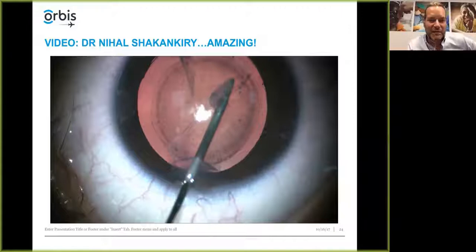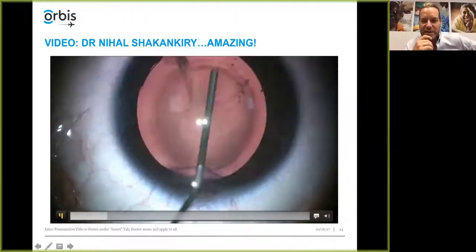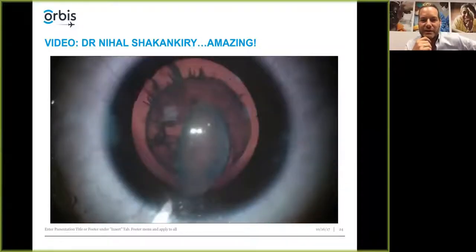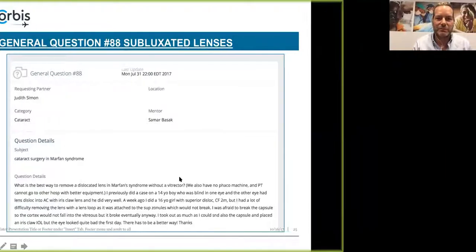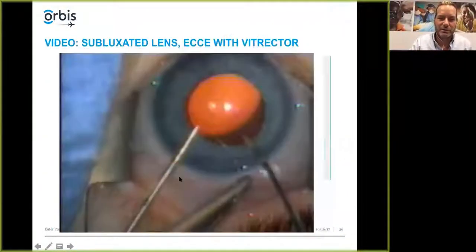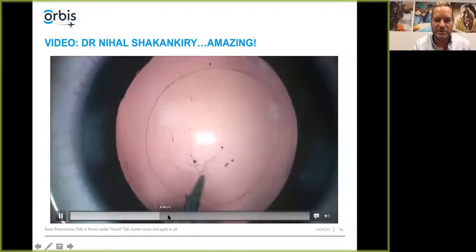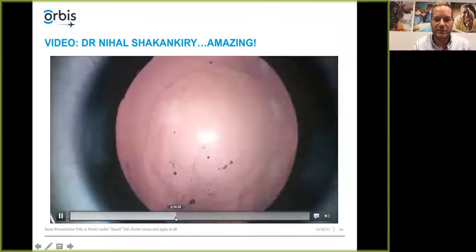But I like the fact that she makes room in the middle by taking the saline cannula and doing some hydrodelineation and dialing that nucleus like that. Because you need a little room and, all right, there you go. Advance back. Okay, so I came out of our video. All right, so I like this instrument that she uses, and I'll list these instruments on the website later on.